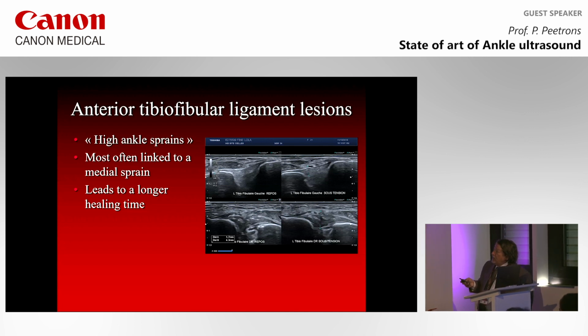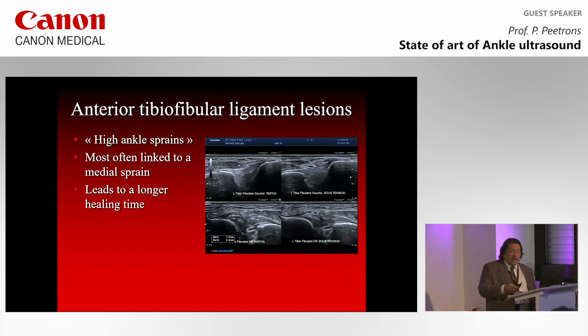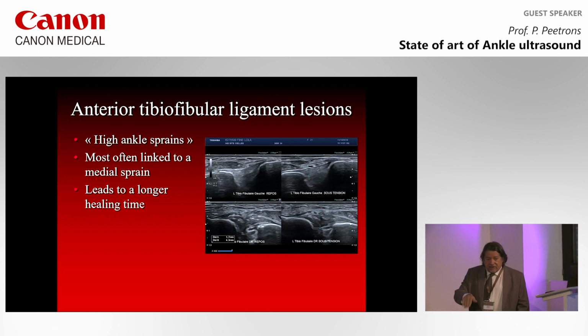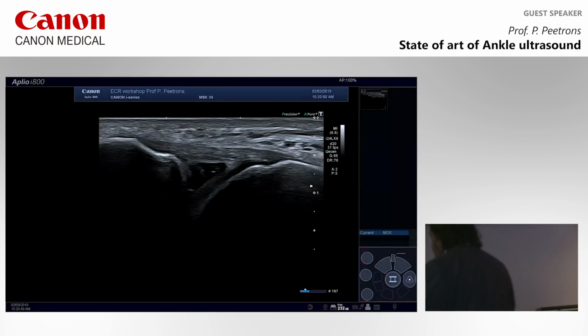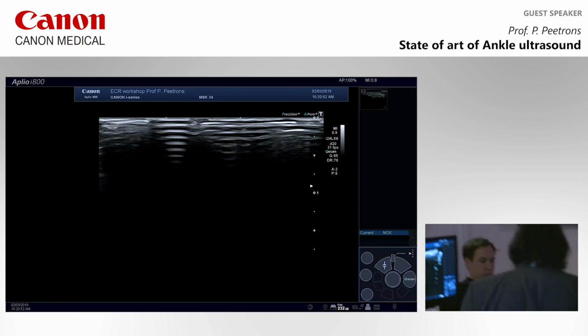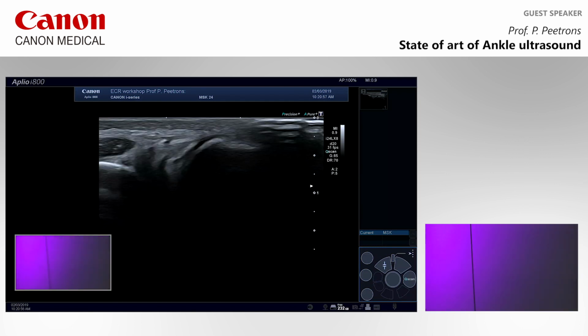This is a normal anterior tibiofibular ligament, I'm sorry. This is without stretching. This is with stretching. How do you stress this ligament? Do you know? We stress this ligament, I will show you, by doing a dorsal flexion of the foot. Why is it so? It's because we can see this ligament very clearly between the fibula and the tibia, like this.